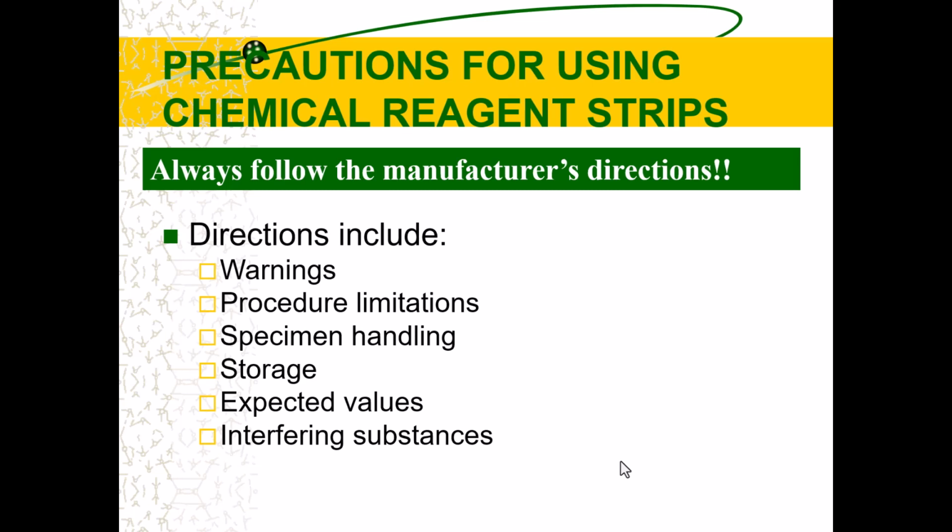So read your inserts, read the directions, read the warnings, the limitations, handling, storage. Most of the time, things get stored on the counter. All of a sudden, this new kit might need to be stored in the fridge. You don't know. So it's really important to make sure you read all your manufacturer's directions.